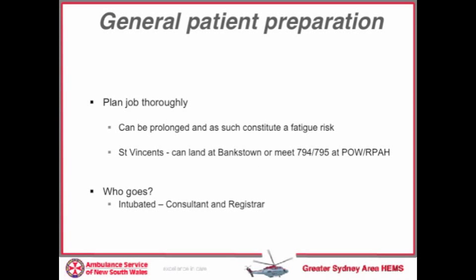Balloon pump jobs are invariably long missions and as such should be planned thoroughly. When there is a road component, we recommend you land at Bankstown and transfer the last part by road in 794 or 795. In terms of who should go, if it's an intubated patient, we recommend 2 doctors, consultant and registrar, consultant to manage the balloon pump and registrar to look after the patient.